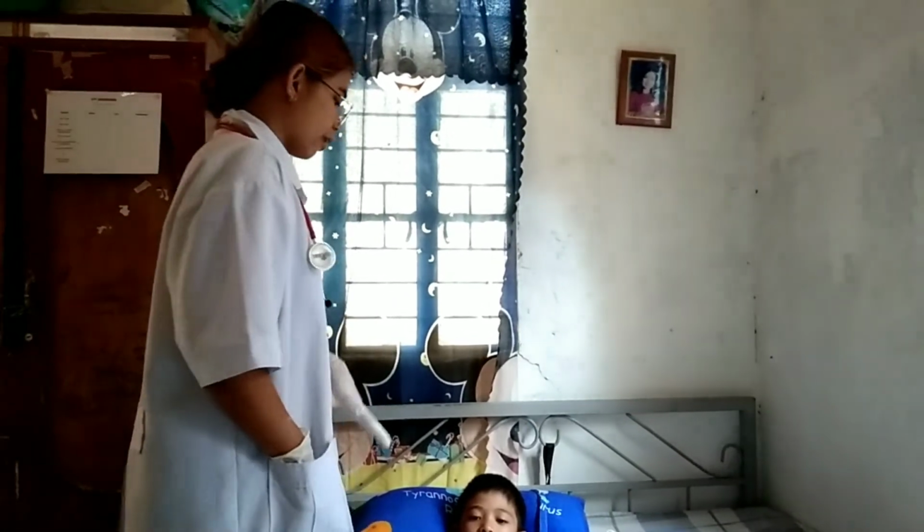Good afternoon, sir. I'm Rochelle and I'm your nurse for today. So for today, we're going to do the assessing of your temperature.